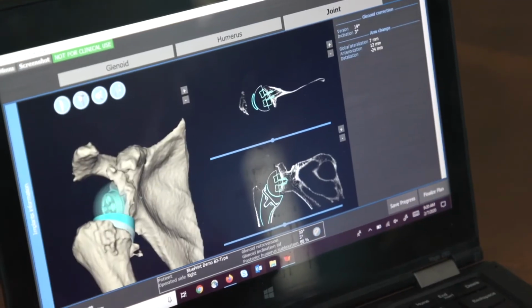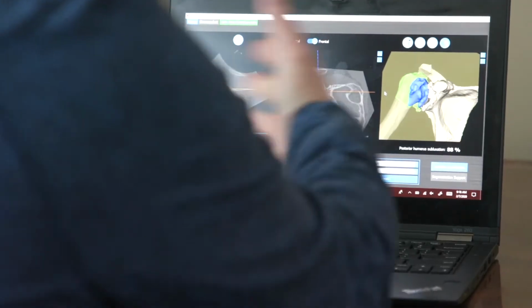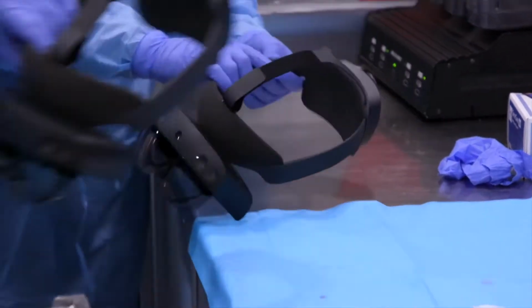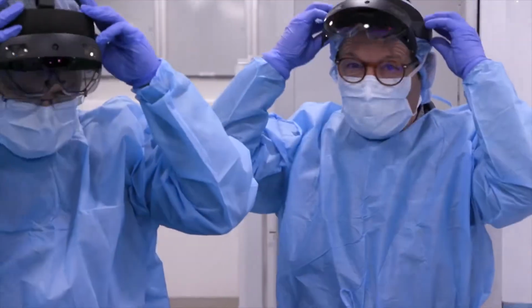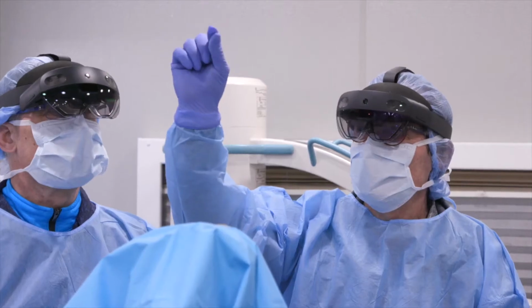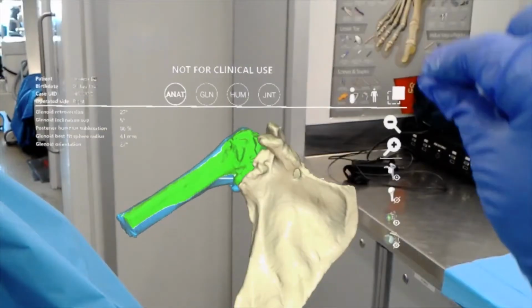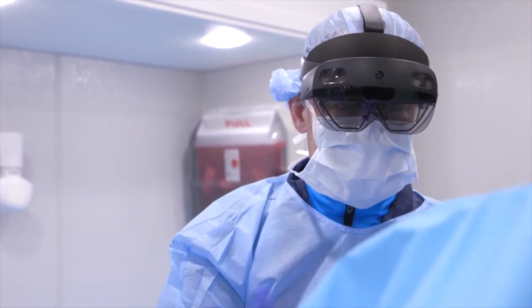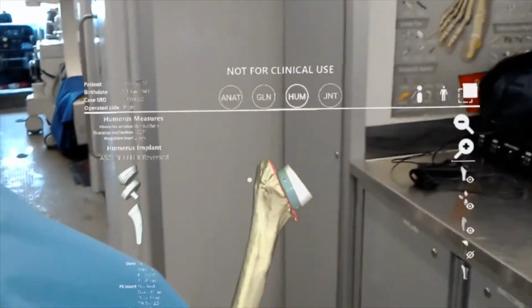The shoulder problems that we treat are three-dimensional problems, and yet we have a virtual plan that's represented on a computer screen in 2D. And our brain is trying to see this in 3D. When we go to mixed reality, we have 3D next to a 3D problem. And that means that you see the three-dimensional image adjacent to where you have to operate. We will have glasses, and that will help us to reproduce the preoperative planning and make sure that the patient benefits of all the new technology.